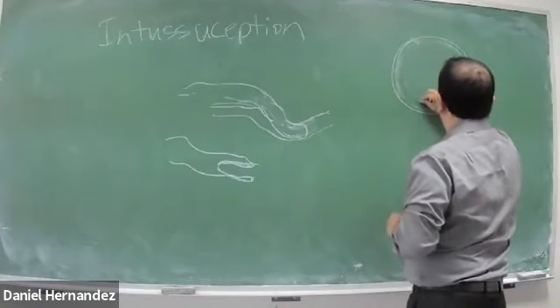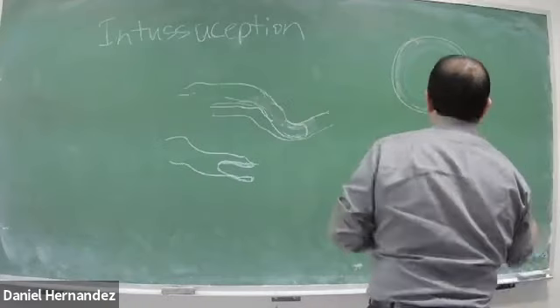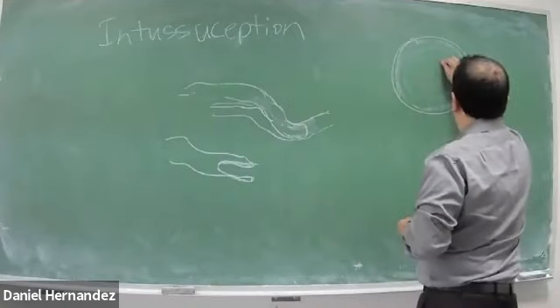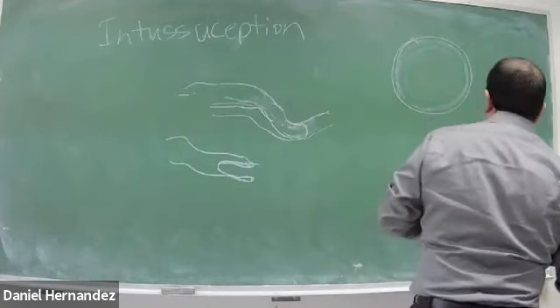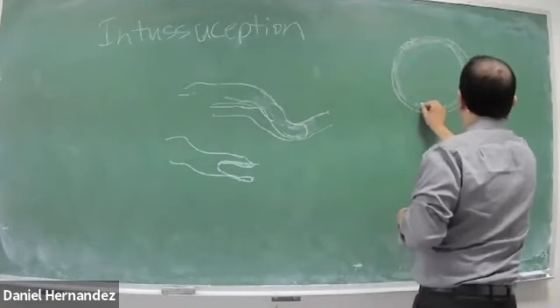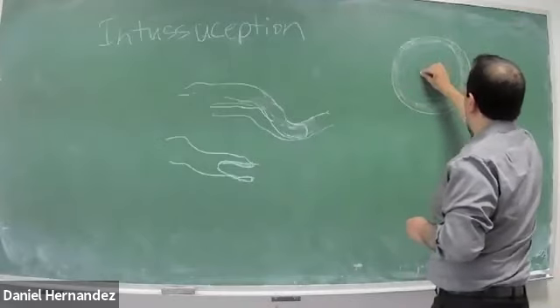You'll be able to discern some of these multiple layers.